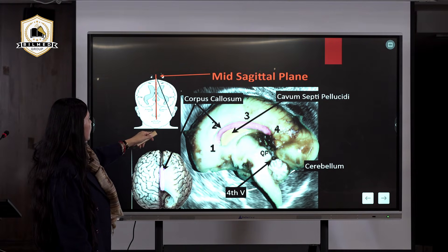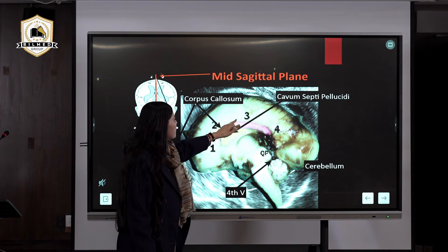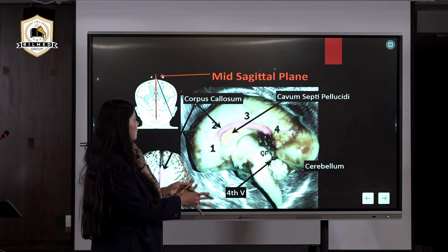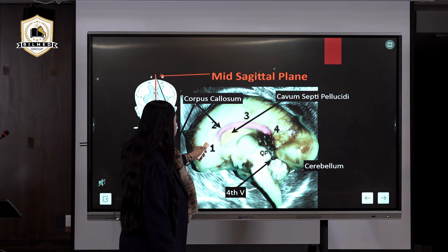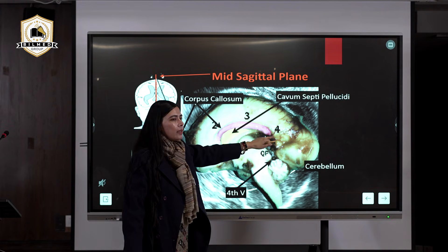If you are knowing anatomy nicely, nothing is difficult for you. This is corpus callosum. Can you see the connecting point of the two cerebral hemispheres? These are the four parts that we discussed: rostrum, genu, body, splenium.